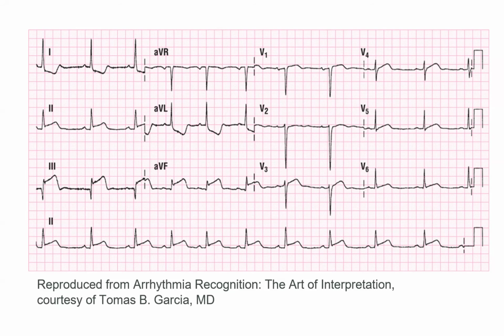So that's your team, kind of like a big, clear example. This is very clear. Yeah, this is bad. This is what we look at as an inferior STEMI most likely. We do have to finish it.